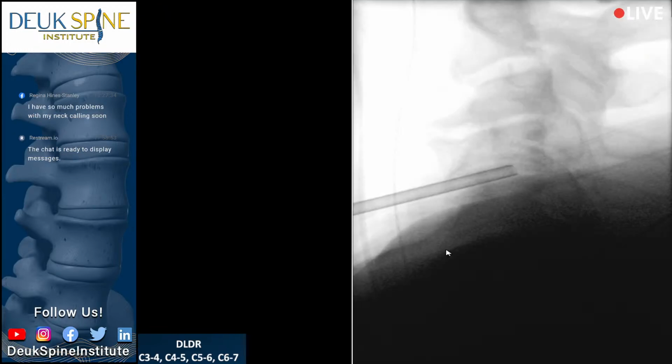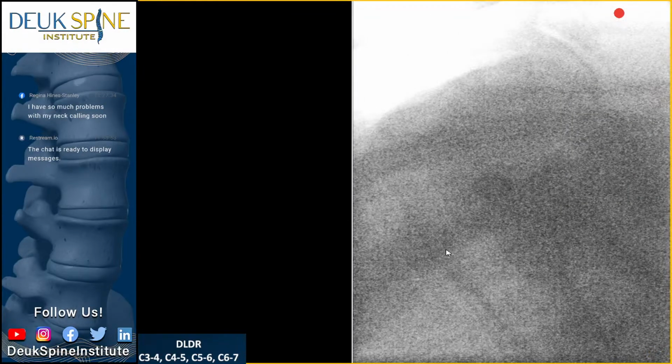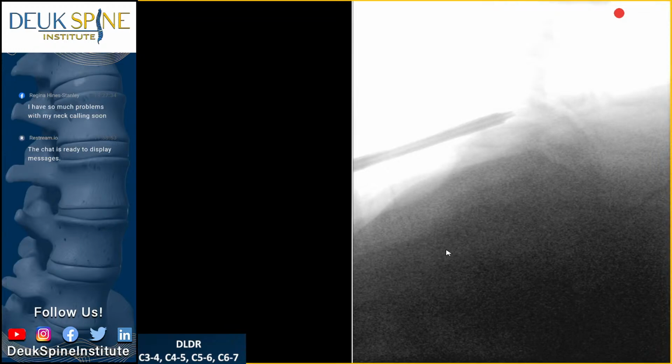Fluoro is an x-ray machine because that's how I guide my tools and I learn which level I have to go to. It's called localization and navigation. Navigation is moving surgical instruments around in a patient's body. We call that navigation. You are navigating to a place that you want to treat. So we use the x-ray machine for navigation, and we also use it for localization. All right, take a shot. It's too low. So we're going to use this fluoro now to navigate my instrument to the next disc that I'll be fixing.